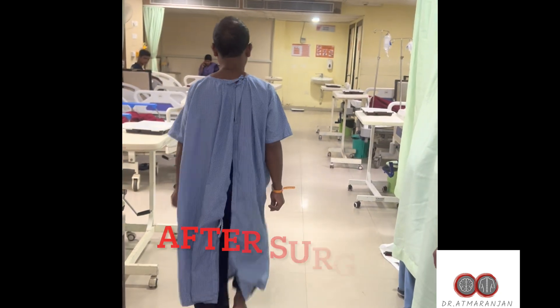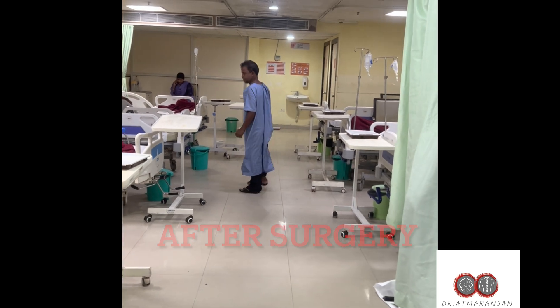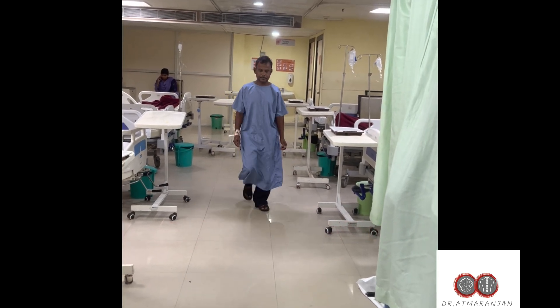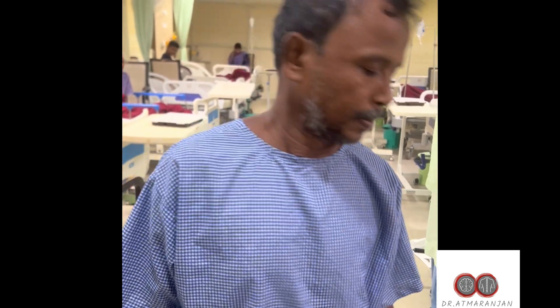The patient is discharged on the same day, just after surgery. These procedures are designed even for pilots — they can undergo surgery on weekends and fly again on Mondays. The procedure is very safe.